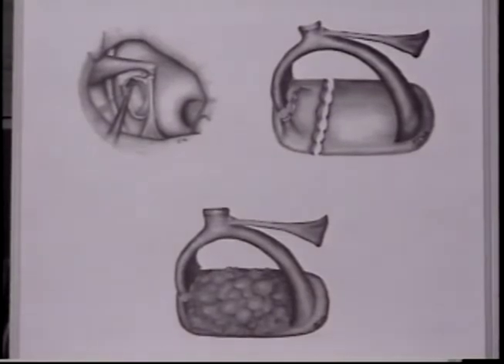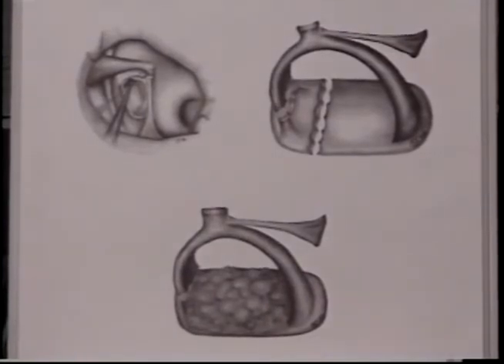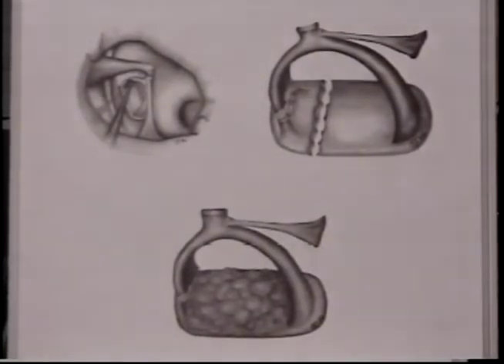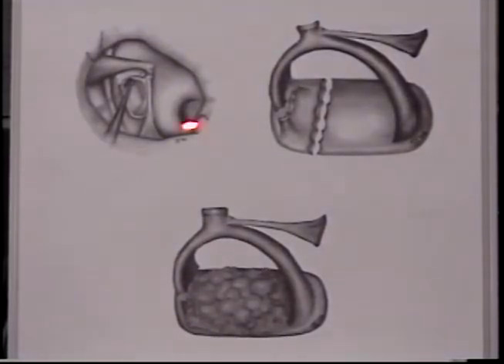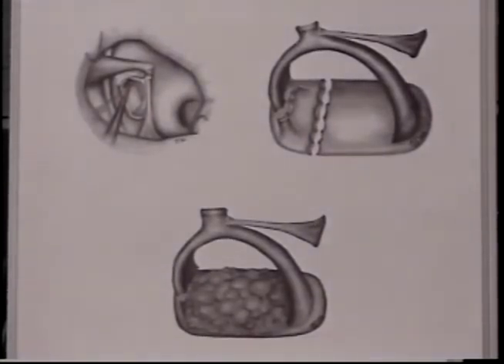Four or 5 years ago, in 1994 to 1995, I developed a procedure which I call the laser stamp procedure, which is a laser stapedotomy minus the prosthesis. This is quite an advance because we can now restore the patient's hearing without using a prosthesis. Unfortunately, it only can be done when there's a minimal amount of otosclerosis fixing the stapes, and the patient has a nice blue footplate. This occurs in about 40 to 50% of the cases where we have anatomy that allows us to do the procedure and minimal fixation.